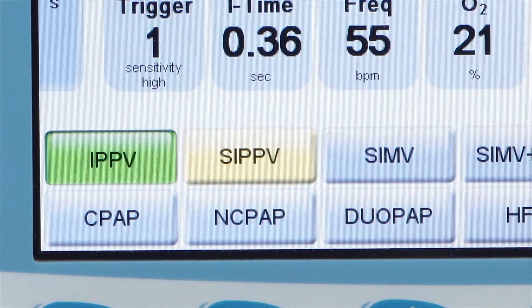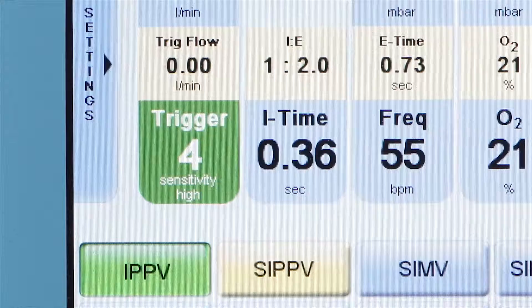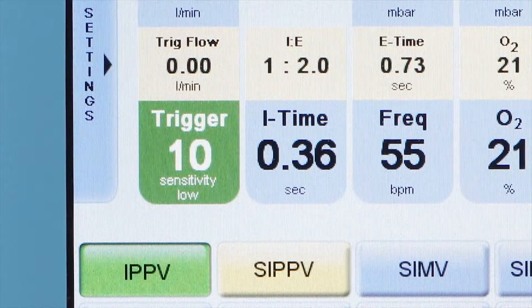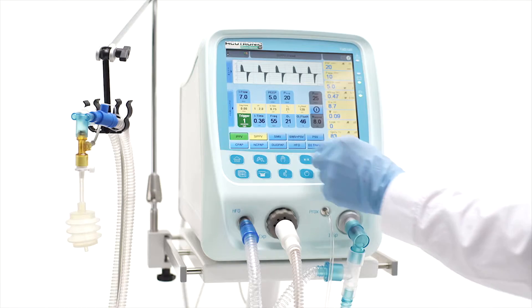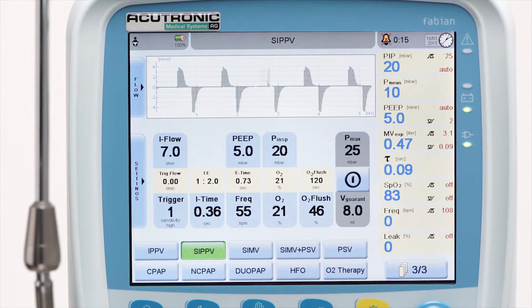SIPPV mode allows the patient to trigger a time-cycled, pressure-limited breath. Each inspiratory effort of the patient reaching the preset trigger threshold level will initiate a breath. The number of breaths per minute is determined by the patient.